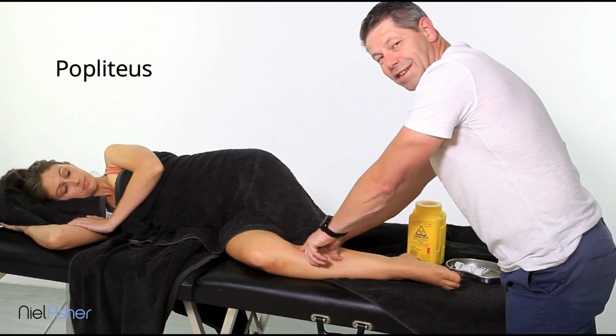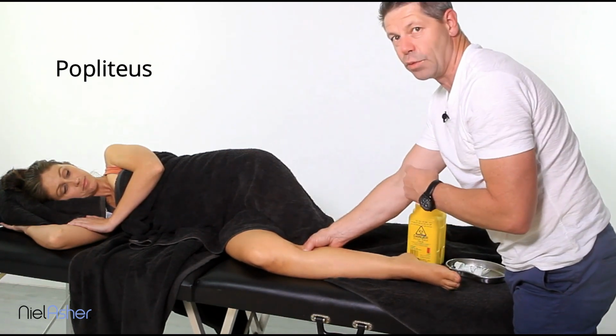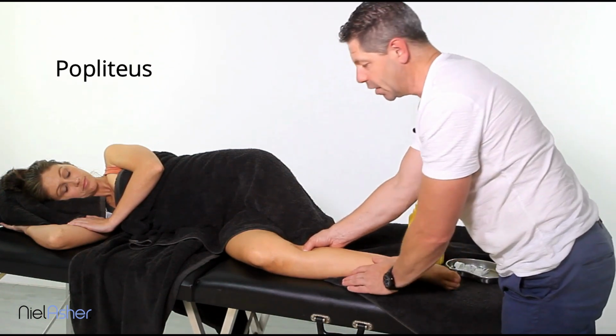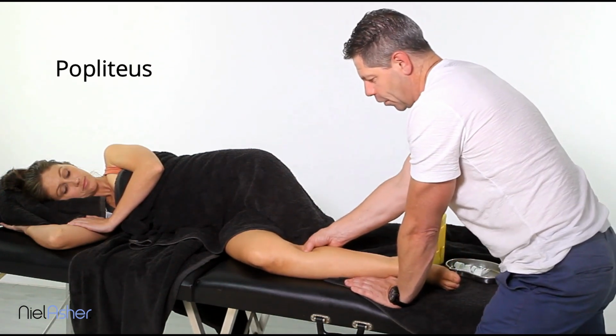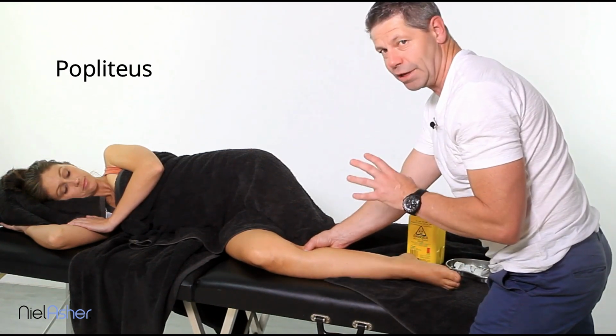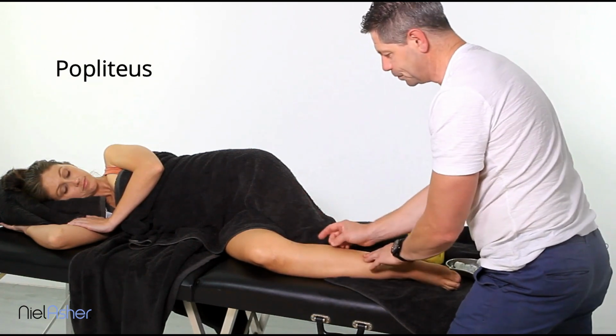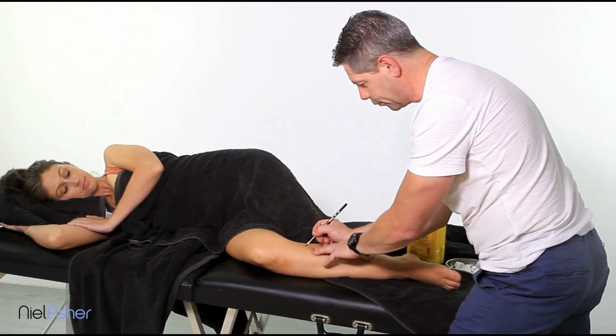Now, why Popliteus is so important: it unlocks the knee when we stride. We've mentioned this a little bit before when we talk about lower limb injuries. So it is very highly important, and as I said, in terms of medial shin pain, it is really important because it allows that knee to get into full extension. So that's the first trigger point right through there.